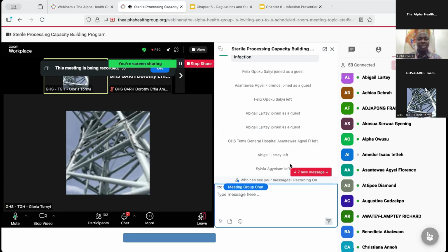I'm talking about infection. This is under infection prevention and control. When you handle these instruments with universal precaution standards, you process them the way the manufacturer tells you to. You make sure that you are transporting them, that is where the regulations come in, from one place to the other, making sure you don't cause cross-contamination.